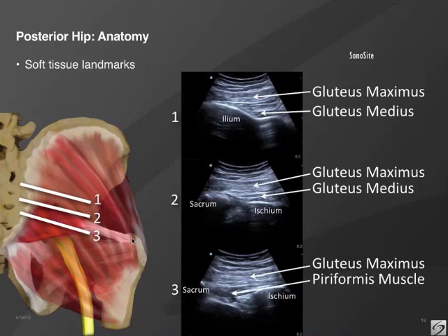This tendon attaches posterior-superiorly on the greater trochanter. And you really don't see that until you get down this far inferior. Now we are longitudinal on the muscle. You see it here. And we go as far as the ischium. We don't yet have the greater trochanter in the picture. It's more lateral out here. But this level of scanning number 3 is what we want to see.